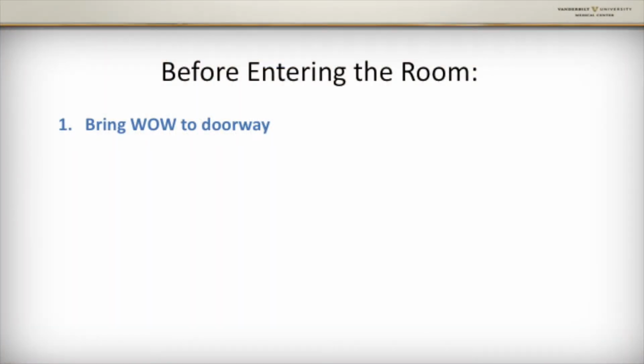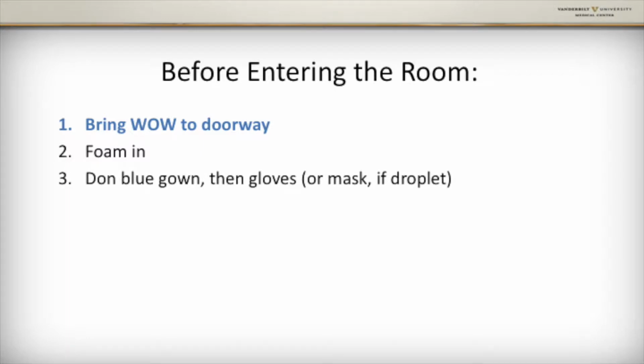Before entering the room, you will bring the WOW to the doorway, foam in, and then don your PPE.